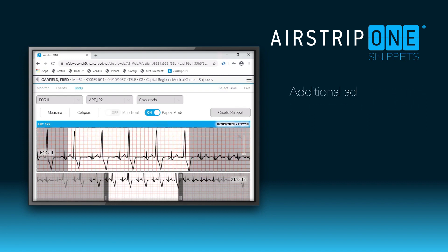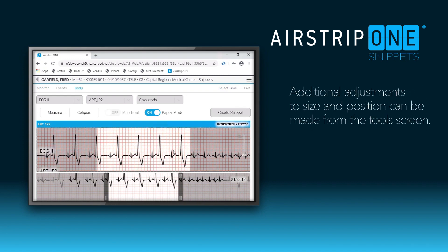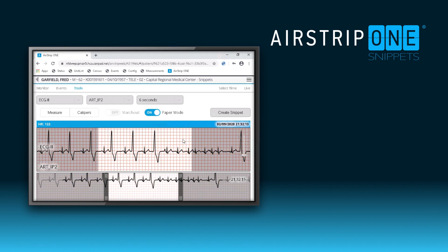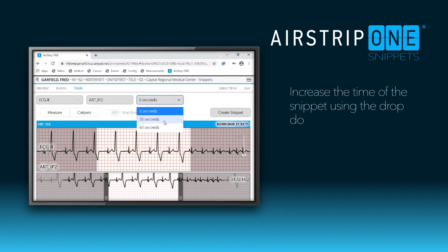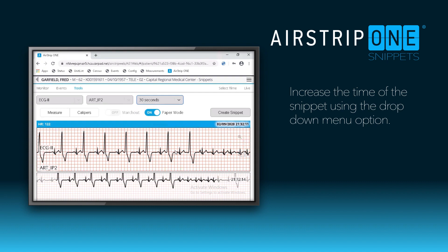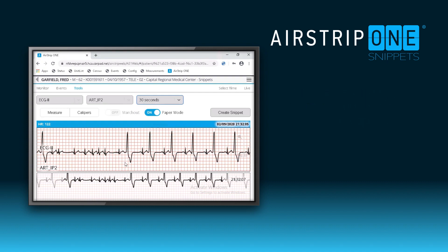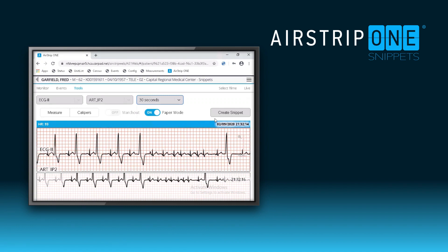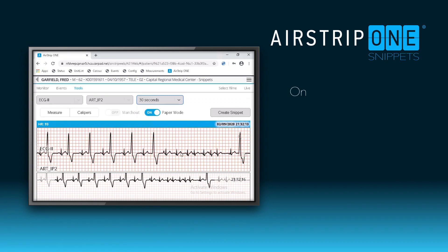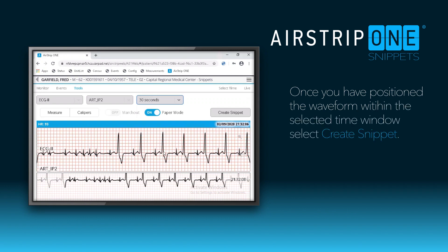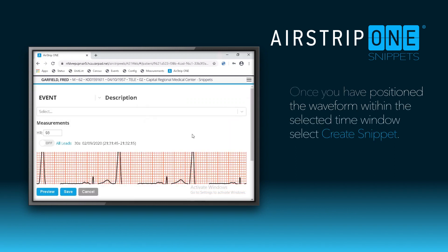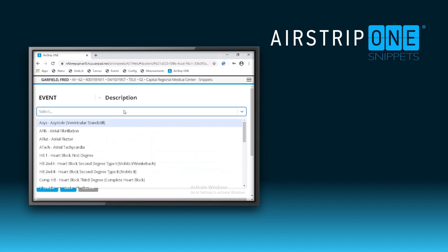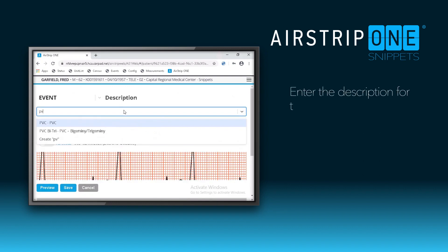You can make minor adjustments to the position and size of the waveform from this screen. You can also increase the time of the event to capture more of the strip by using the dropdown option. After changing the time, you may need to reposition the strip. Once you are done adjusting the strip, go to Create Snippets. You can see that all of the strip was captured. Enter the description and then preview your snippet.